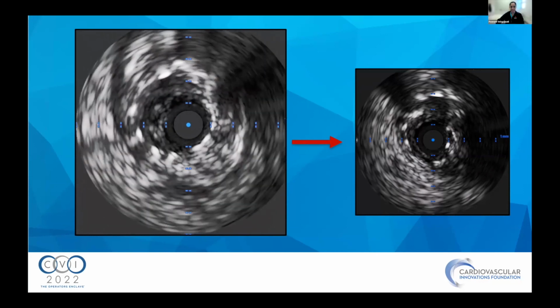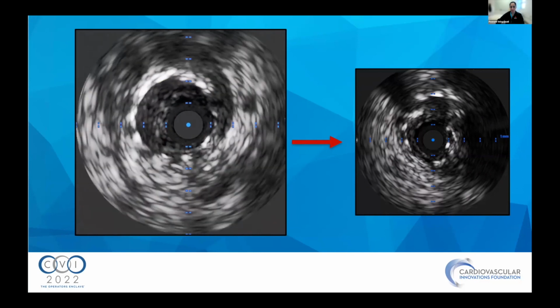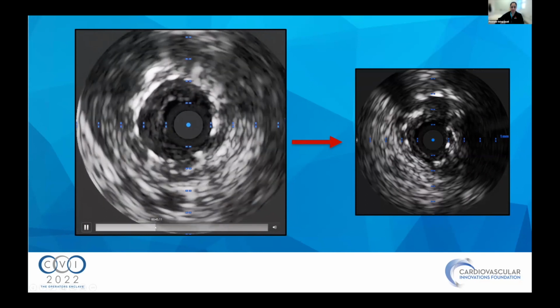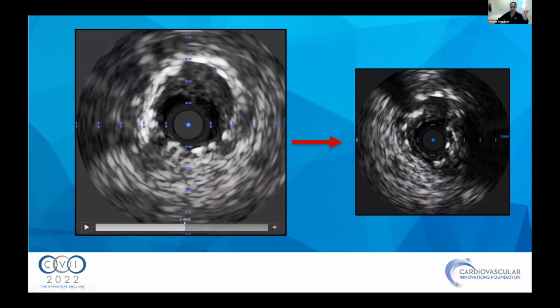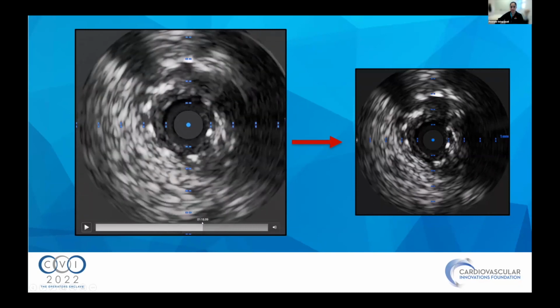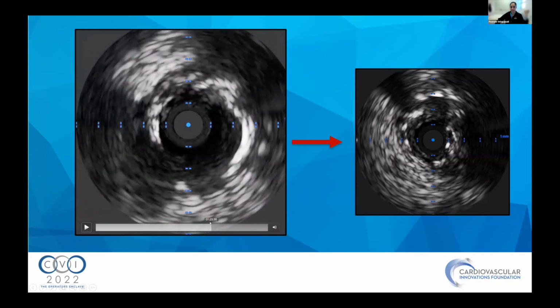Yes, yeah. So again, all the neointimal hyperplasia, and then the figure of interest is on the right. There was some underexpanded stent, like right there. You can see there's a lot of calcium.